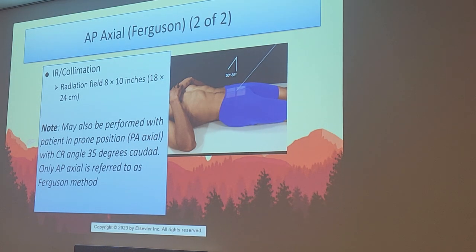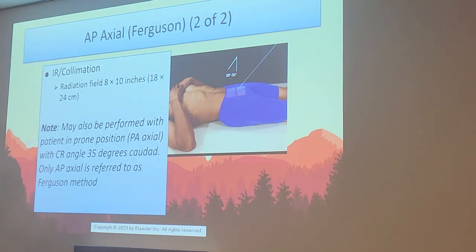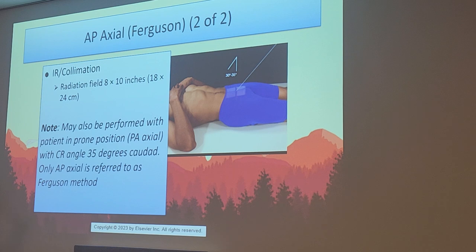All right, so collimation, guys. Tight collimation on this one because we're only interested in that open joint space, the L5-S1 joint space. So it needs to be a tight 8x10 collimation. There's a note there that you can do this in the prone if you so choose. It's a comfort issue, but once again, stick with the AP. It's just going to be better. It's going to add a lot of work getting them prone. But it is an option you can choose. You're going to change the direction of your angulation. The centering will be the same.